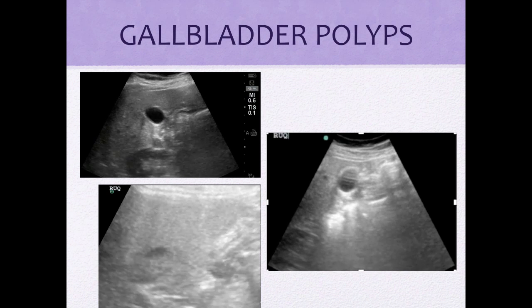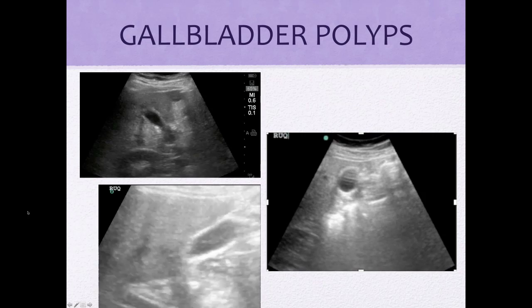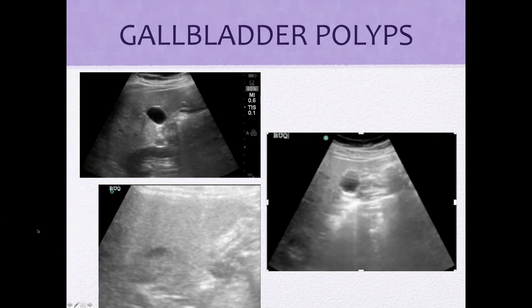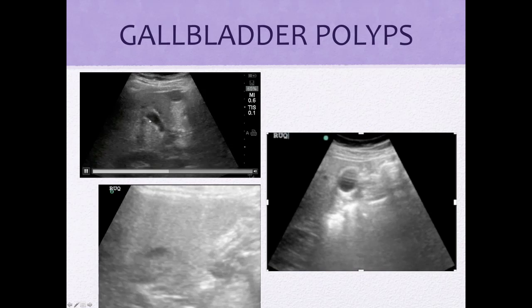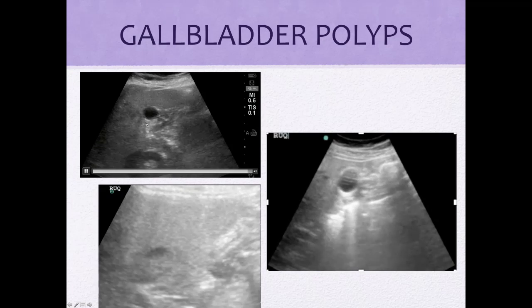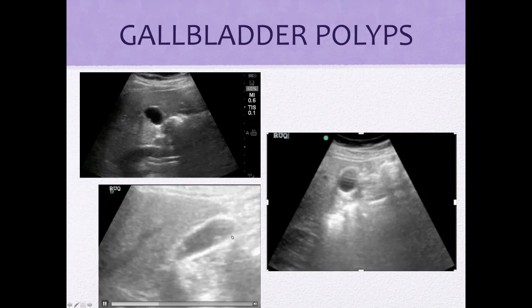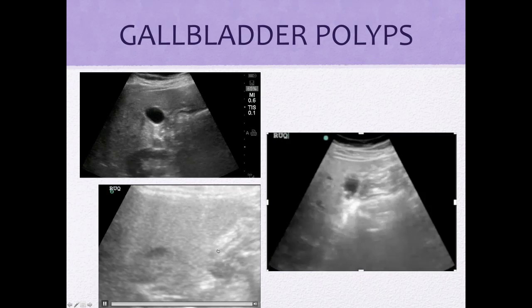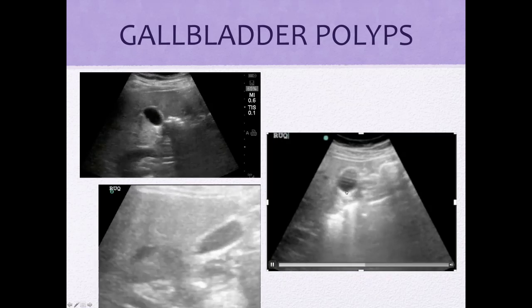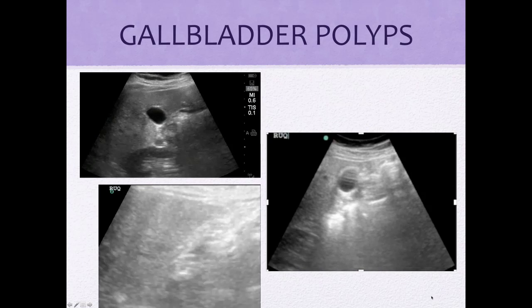Here are some examples of gallbladder polyps on ultrasound. Notice echogenic foci without shadowing. In video one, there's the polyp. This one has a couple of polyps — right there and right there. A few polyps down here as well, and look — no shadowing.